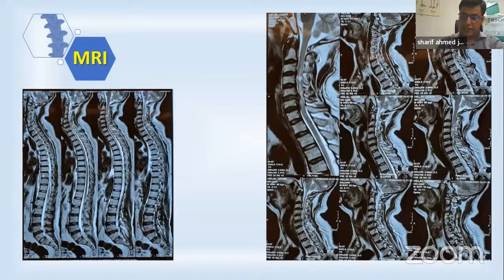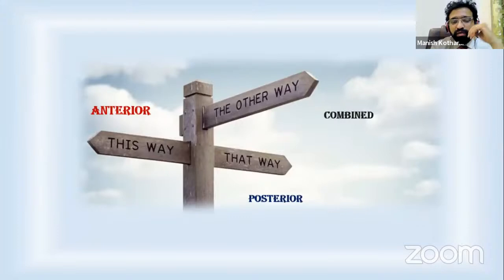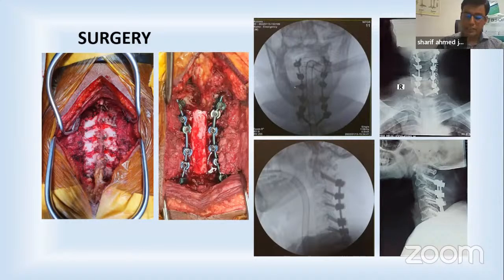Dr. Junaid, I had one question. The lordosis in the MRI versus the lordosis in the post-op X-ray is different. Because you were using a long segment instrumentation, you had the opportunity of giving a good lordosis to allow the cord to fall back nicely. Have you thought about it? Yes, yes. This was actually, the preoperative lordosis was good, better than the postoperative. I totally agree with you.